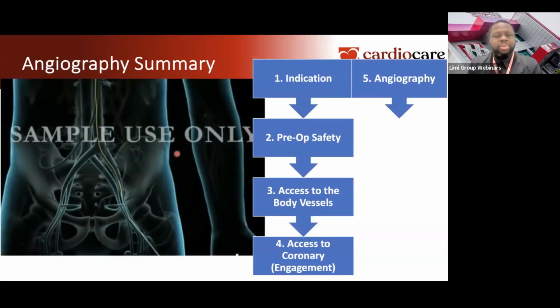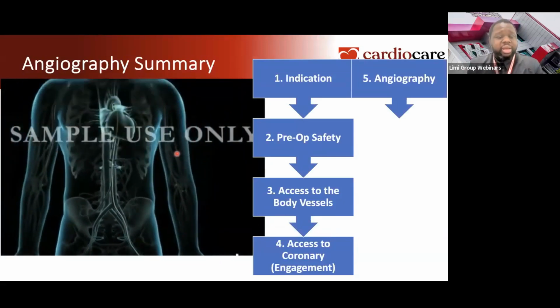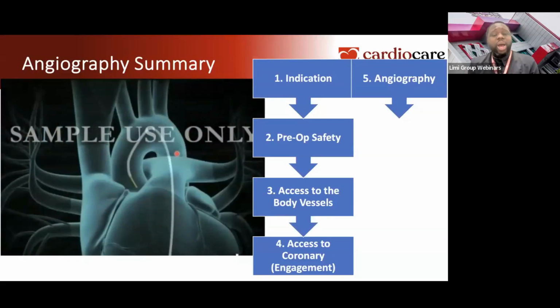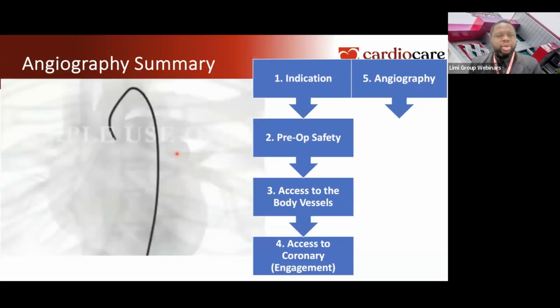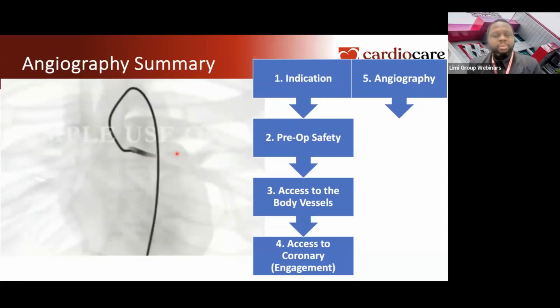And doing the angiogram is nothing more than injecting a special kind of dye into the coronary vessels. This is typically done while the patient is awake. And beyond that needle prick, they should have no scars or problems thereafter. A coronary angiogram is largely safe, typically 99%, 99.5% safety, no issues, no complications.